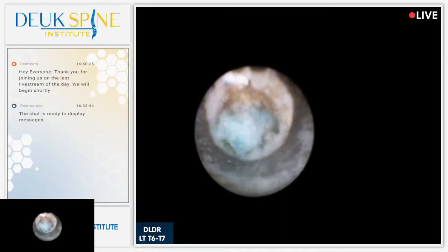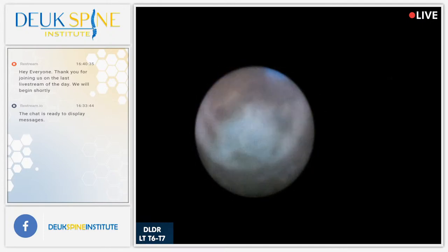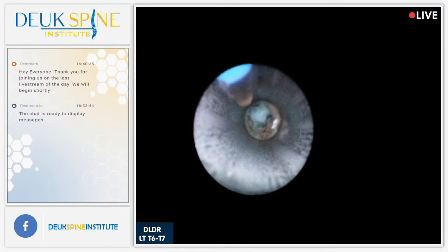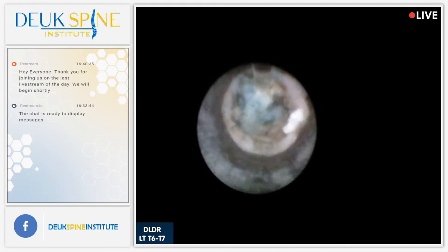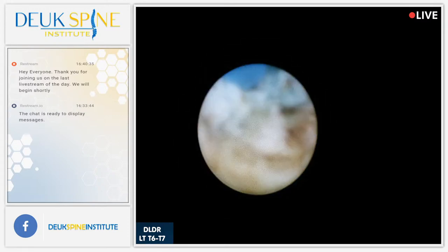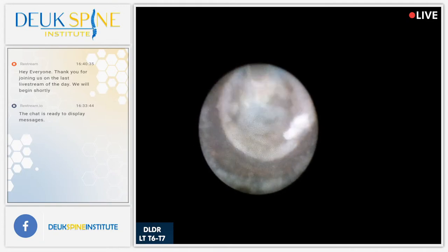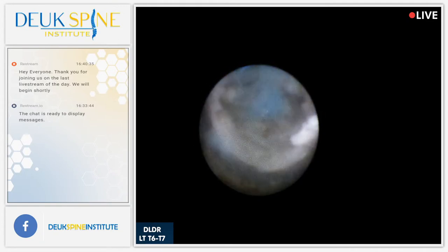All right, welcome back. You're looking down the endoscopic tube and the endoscope. You see what I see, which is the herniation sitting right in front of us, and I'm using the laser to remove it. The inner diameter of this tube is about 2.8 millimeters. This is not as nice of a view as lumbar. Lumbar is definitely better. The reason is this is a fiber optic scope. The lumbar is a rod lens.